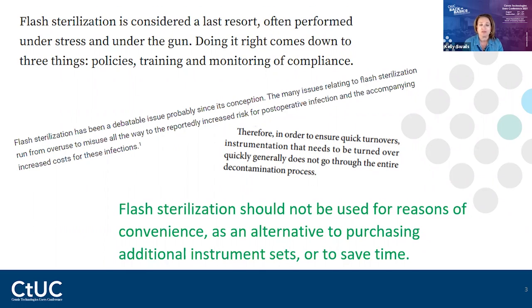But why all the concern? Why the discussion, the debate? When you think about it, the critical part of sterilization is that exposure time, and that's being met. So you have to ask yourself, well, so then why? Why can't we use IUSS? What's the big deal with it?